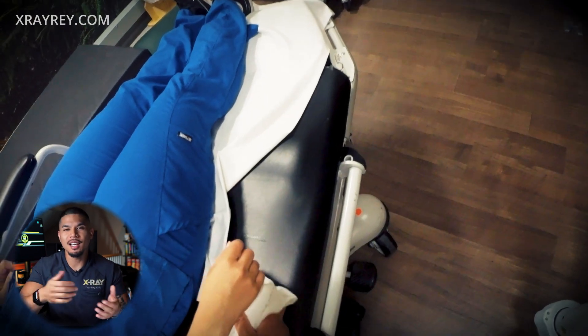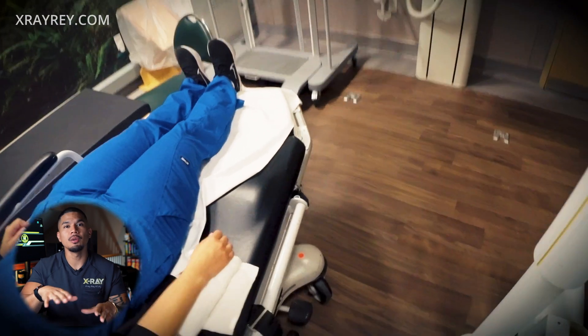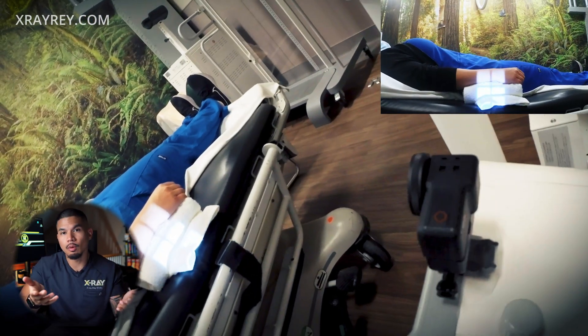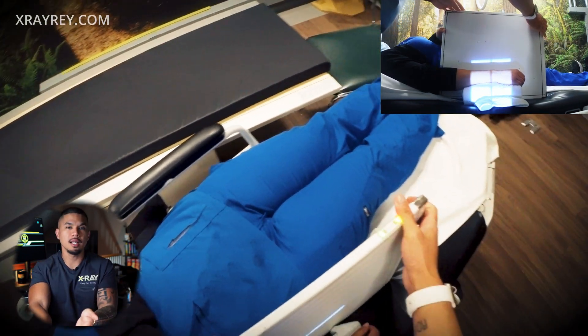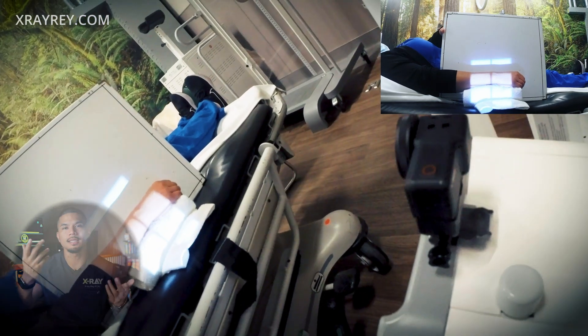That sponge is way too tall — usually a rolled-up towel will do. No towel? You can always use a glove box — this will always, or should, be in every room. Now just place the image receptor on the other side of the wrist. Ask your patient to hold it; if they can't, just tape it up.